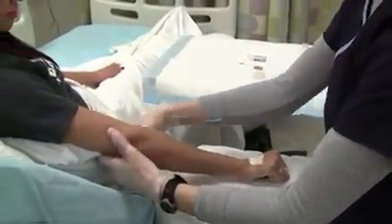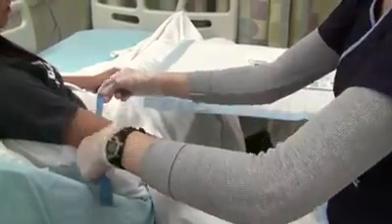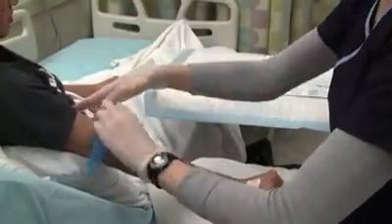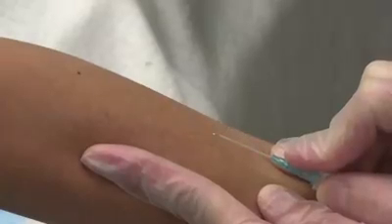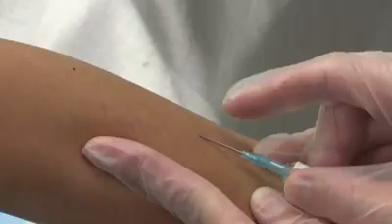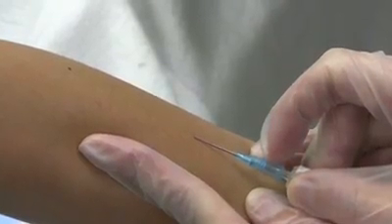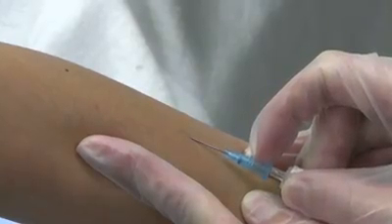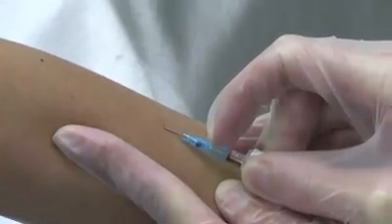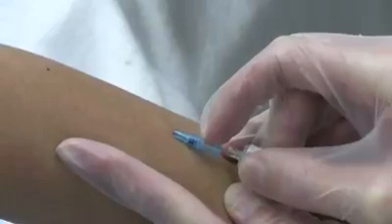Apply the tourniquet firmly 6 to 8 inches above the venipuncture site. Remove the catheter assembly from the sterile packaging. Use your non-dominant hand to pull the skin taut below the entry site. Hold the over-the-needle catheter at a 15 to 30 degree angle with needle bevel up. Insert catheter through skin and into vein.